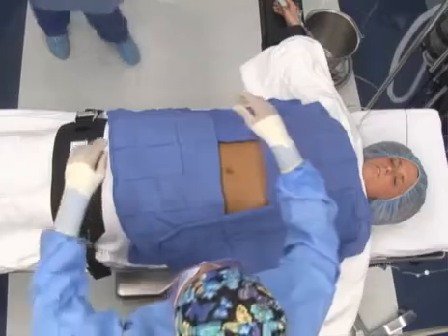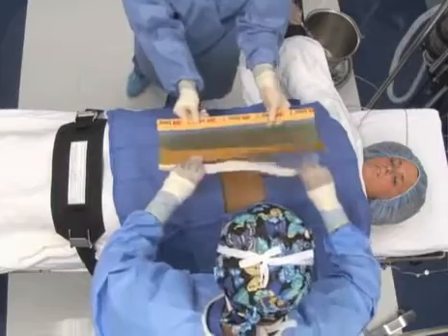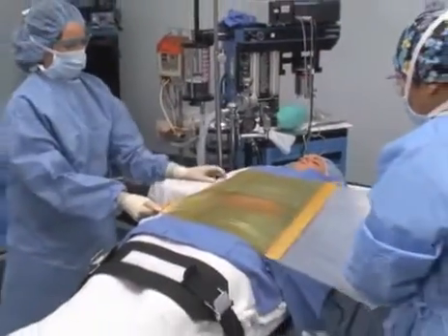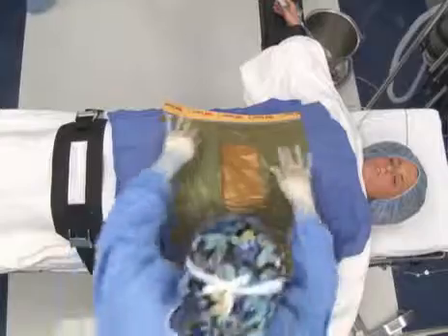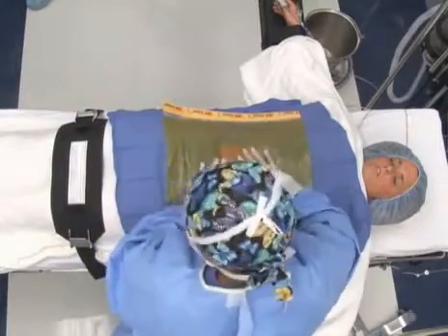The sterile incise drape is coated with adhesive on one side and may be impregnated with antiseptic. The drape is packaged with a paper backing on the adhesive side. The whole drape, including paper backing, is then folded lengthwise and contained in a plastic sleeve wrapping. During draping, the paper backing is peeled away while the drape is applied. This is done in a way that prevents the drape from tangling and sticking to itself.